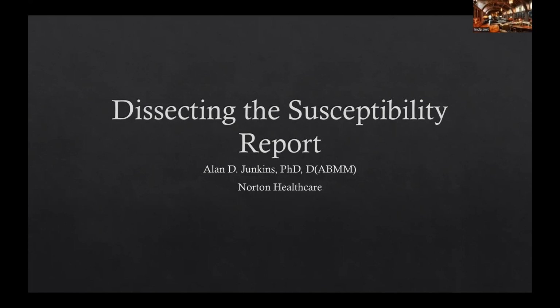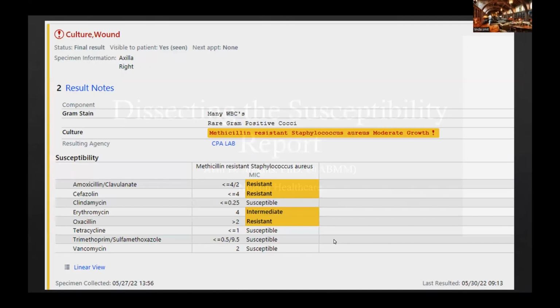Well, thank you, sir. I don't know if dissecting is the right word or not, but it's what I could think of. So, yeah, what I wanted to do was kind of go over the susceptibility report. We've all seen the susceptibility reports. This is one of ours from recently in EPIC. So you've all seen things like this.